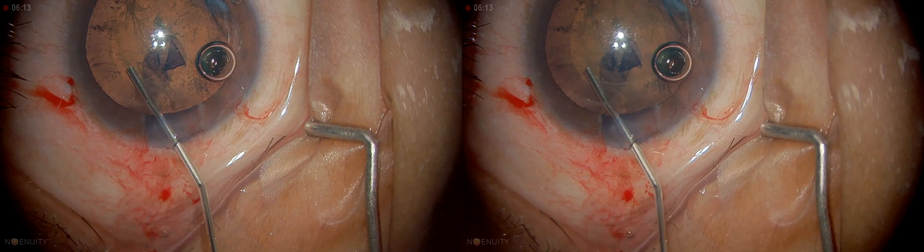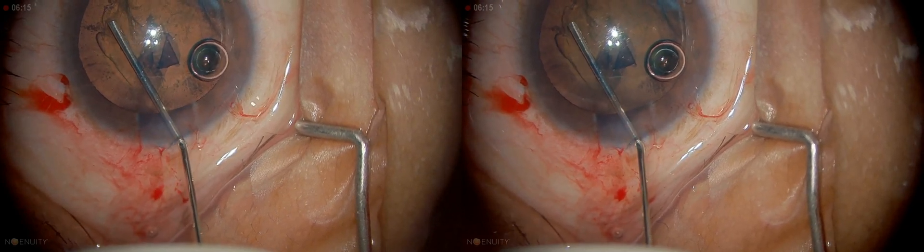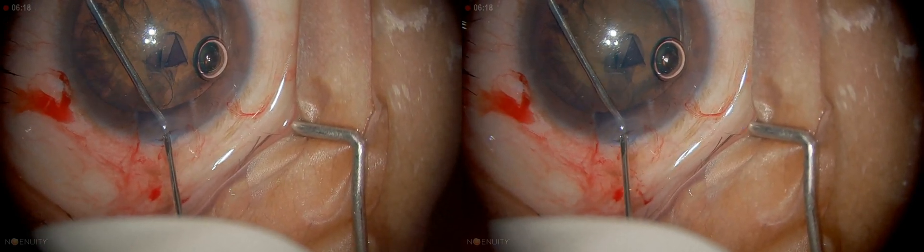Go in, depress, go under the anterior capsule and gently inject. You can see the fluid wave slowly traveling right across.